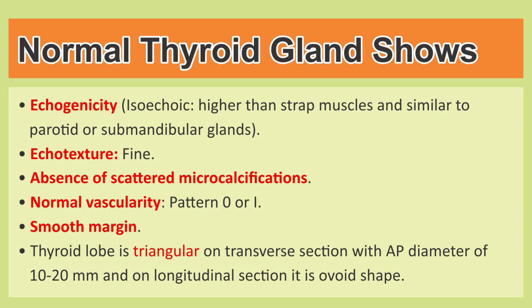The second characteristic is ecotexture, and it appears fine in the normal thyroid gland. Scattered micro-calcifications are not present. Normal thyroid gland will show the vascularity of pattern 0 or pattern 1, and the margins of the thyroid gland are smooth.